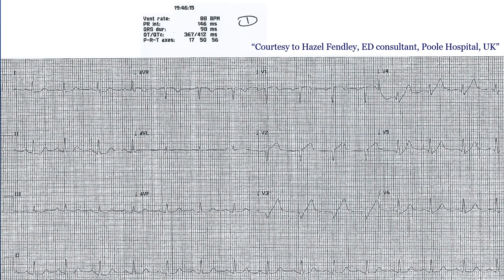Looking at this ECG from an ischemia point of view, there are many concerning things. Starting with lead AVR, there is ST elevation, which is concerning in the presence of chest pain. Looking at the inferior leads, there is ST depression in II, possibly III — though the baseline is a bit wavy — and definitely in AVF. Looking at the anterior leads, there is a weird-looking ST depression with a hyper-acute T wave in V3, V4, and possibly V5.